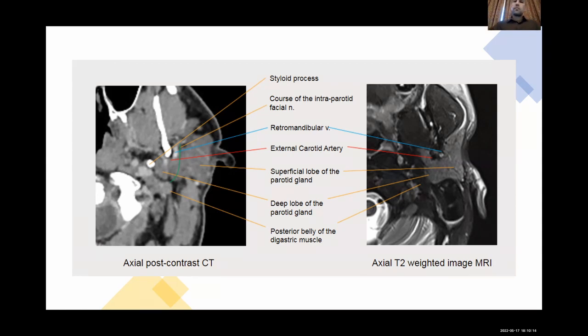Ultrasound, and biopsy, because the head and neck sonographers or consultants usually take consent in the same session and take a biopsy, if they are sure the patient is not on blood thinners, especially for the true cuts. So ultrasound for the neck is crucial, and for the parotid gland it is the first line of radiological investigation.